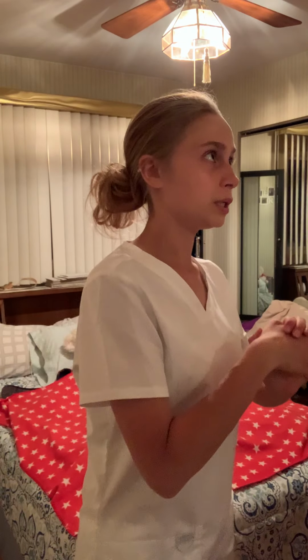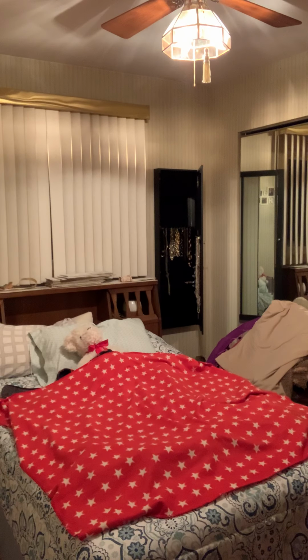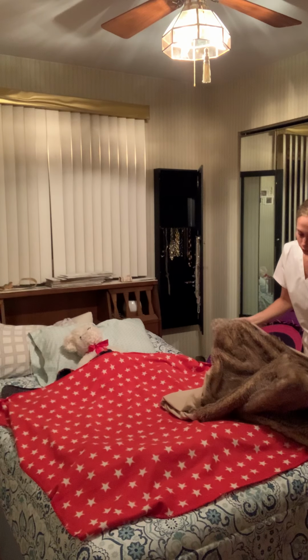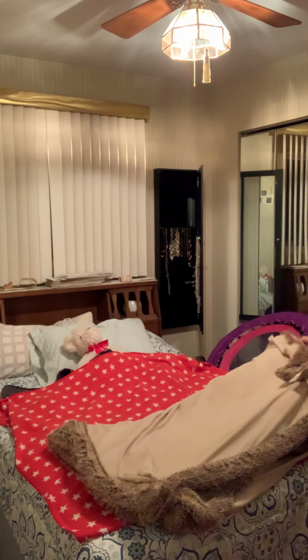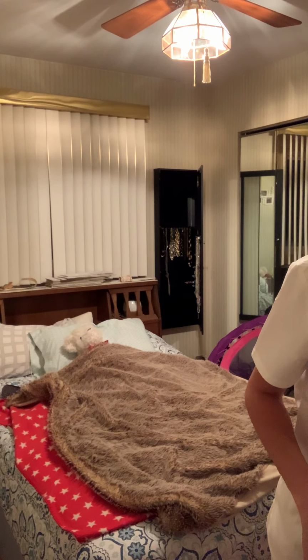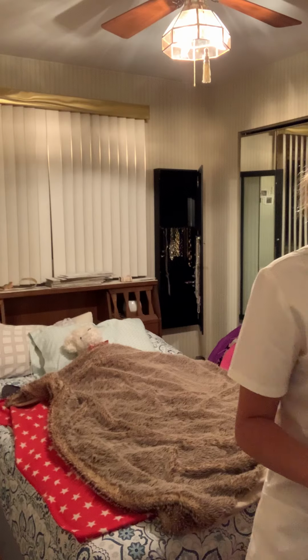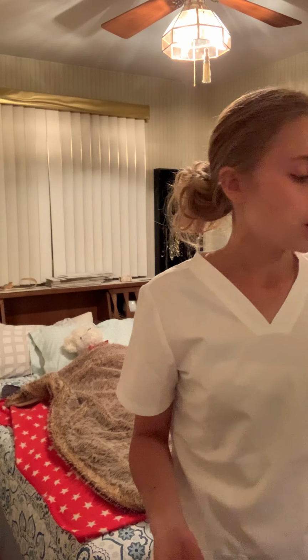So now we are going to be getting the blanket, well, I mean the bedspread. So, getting the bedspread, and I'm just going to fold it this way. Okay. And just make sure the top hem is even with the mattress top. So also turn the top hem of the bed sheet, the bedspread, under the blanket to a cuff.